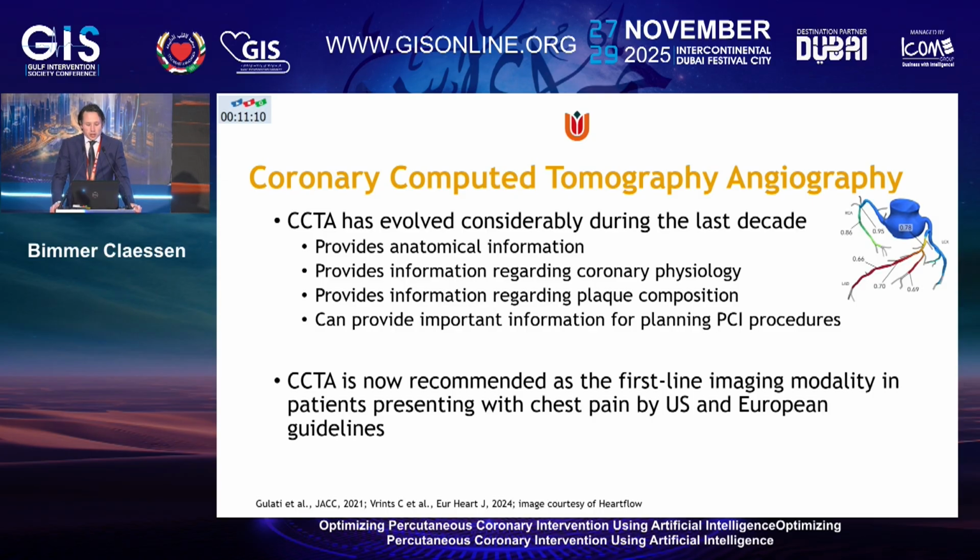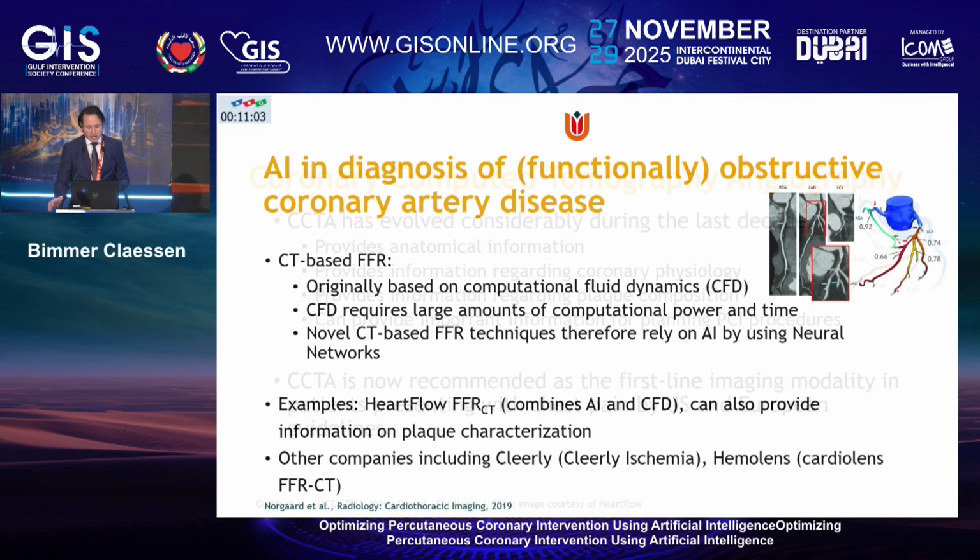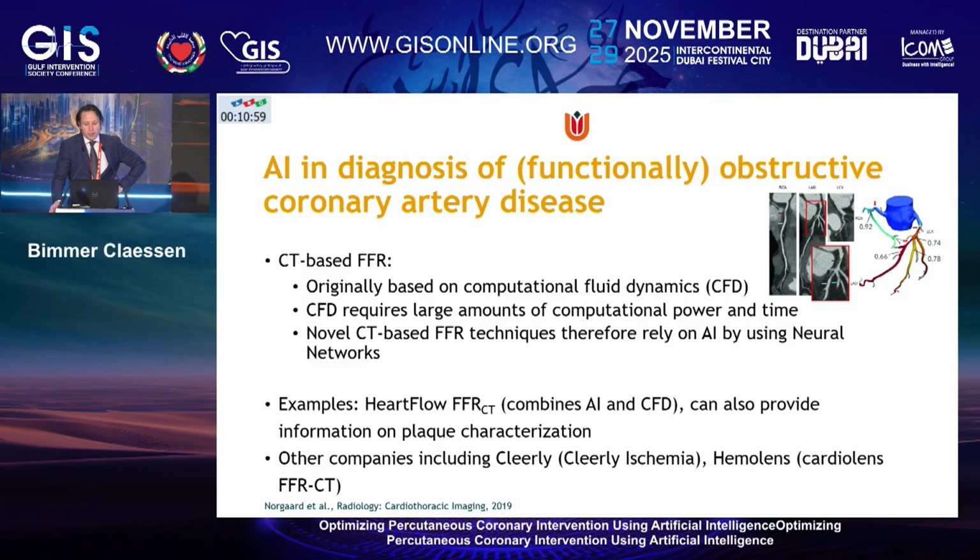And CCTA is actually now recommended as the first-line imaging modality in patients presenting with chest pain by the US and European guidelines. So we can use AI for the diagnosis of functionally obstructive coronary artery disease, going beyond merely estimating the amount of stenosis.